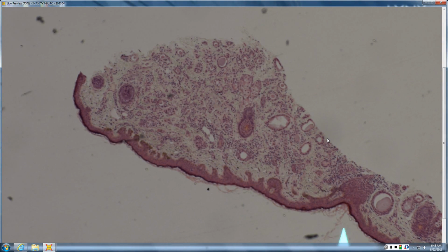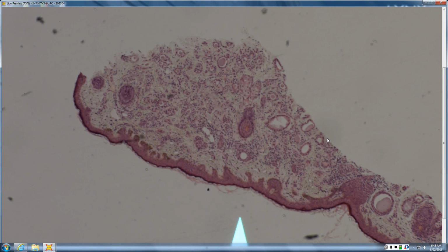But once you know that there's ducts in here, you say, well, it's a very, very small proliferation. There's a little bit of a sclerotic stroma, it's a little redder and thicker and more dense collagen in between. And then hopefully from the history, you would say, oh, it's heavily pigmented skin, so maybe someone of a darker skin type, and maybe it came off of the periorbital location. All those things going together really push me towards syringoma.